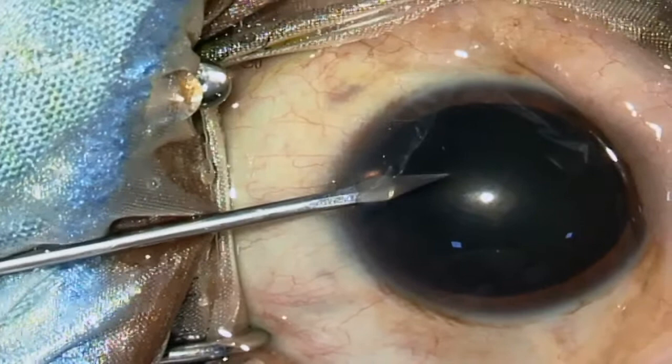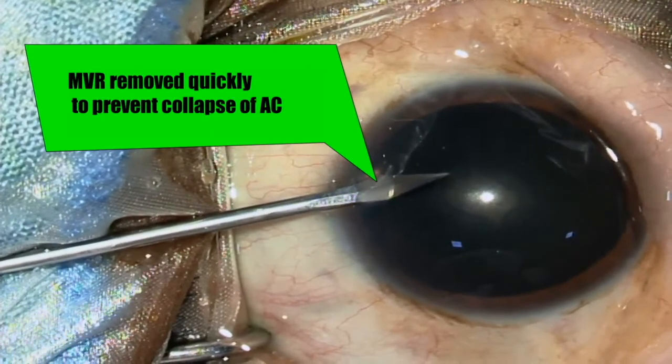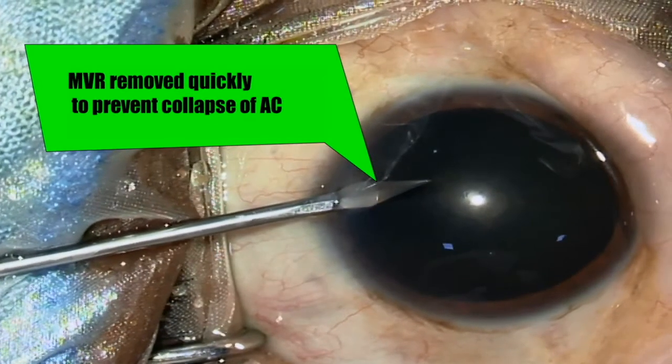It is important to keep the anterior chamber maintained throughout the surgery. That is why side port entry is crucial. We prefer an MVR blade for the side port, which is removed quickly to prevent collapse of the anterior chamber.